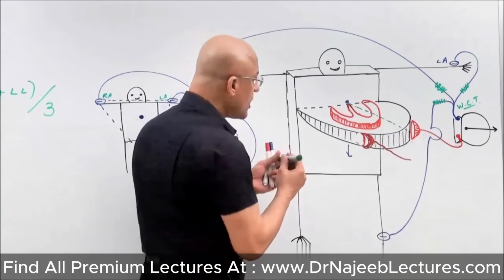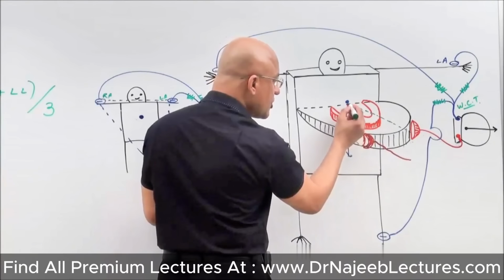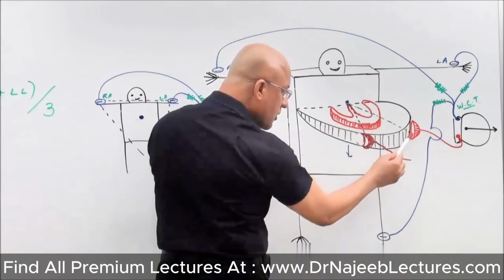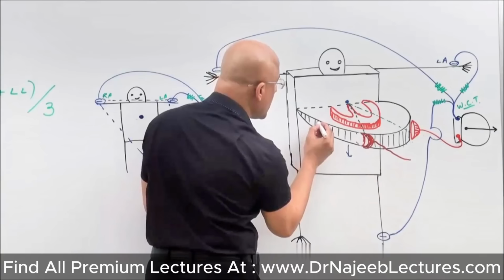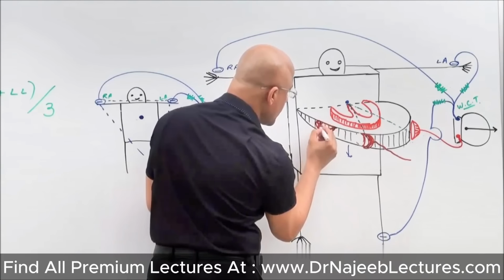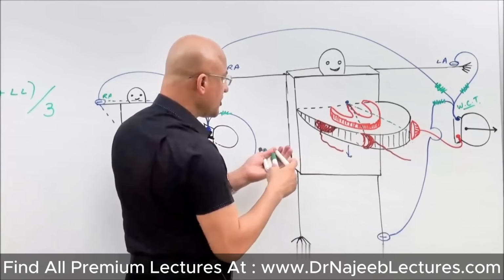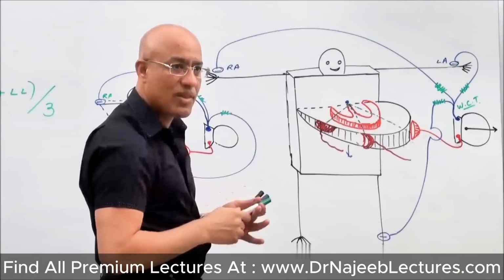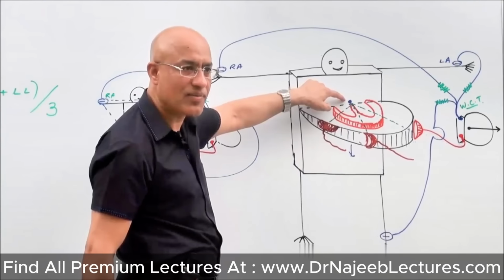But if we move the positive electrode here, right? Then the axis of the lead will change. And if you remove it from here and apply it over here, now the axis of the lead will become like this, because the negative pole will remain the same, indifferent.